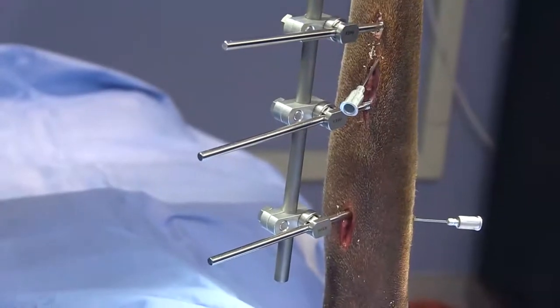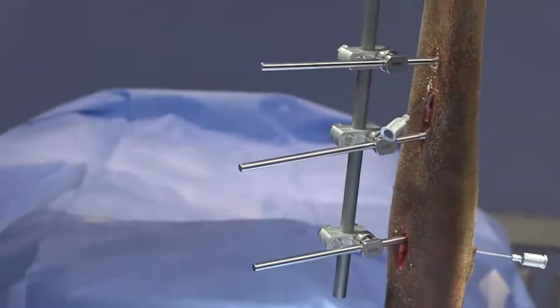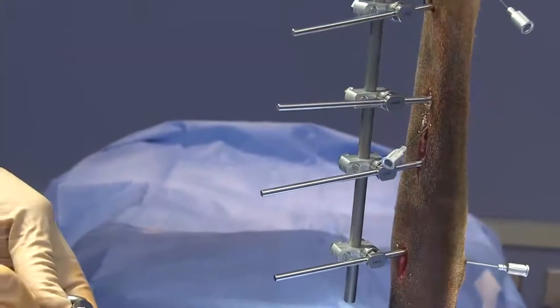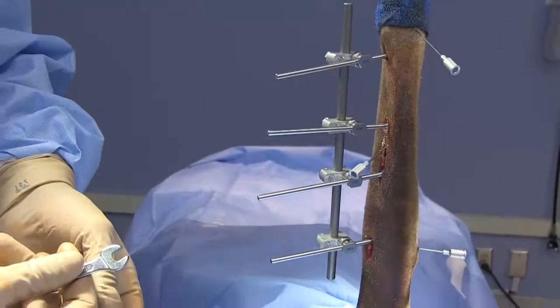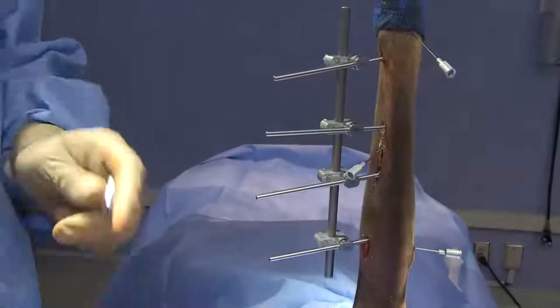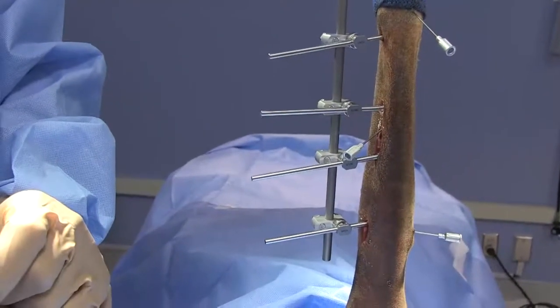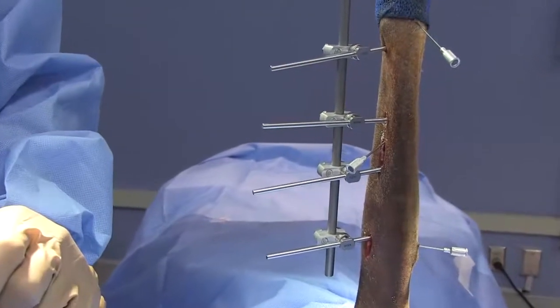We've engaged the opposite cortex — go ahead and get our drill bit out, remove the drill sleeve. And there we have our type 1a construct — a type 1a linear external fixator applied in the cranial medial plane. For a lot of smaller dogs that would be a pretty good repair. We try to place three pins in the distal and proximal fragment. Since this is a larger dog, we're actually going to go ahead and turn this into a type 1b.